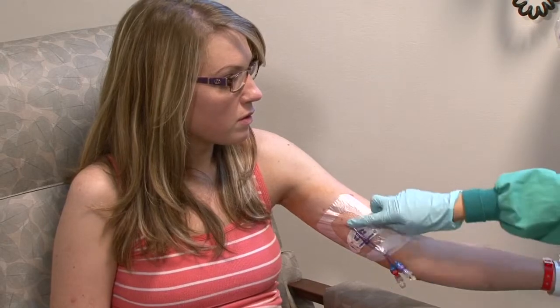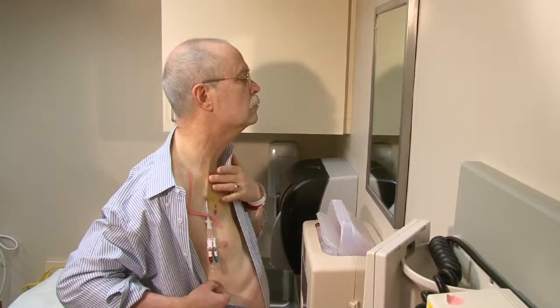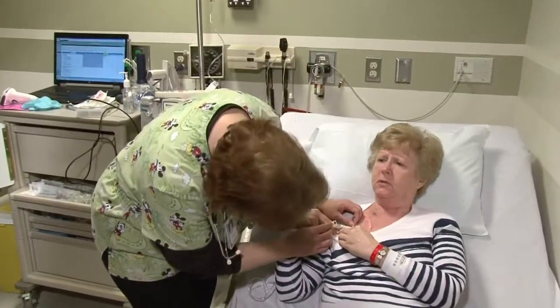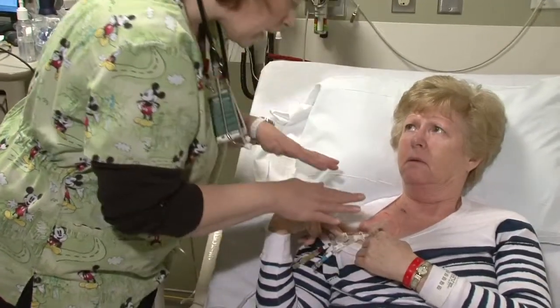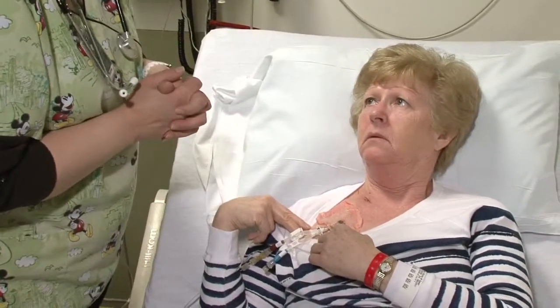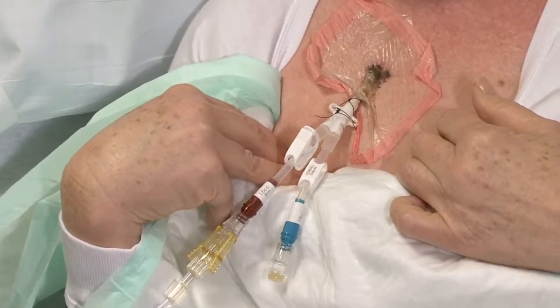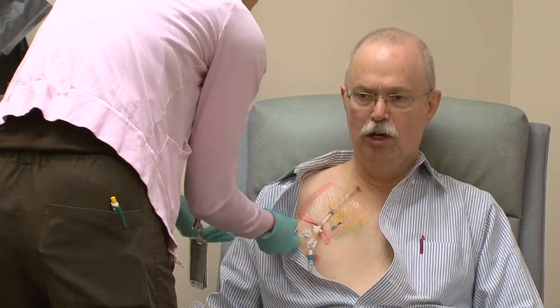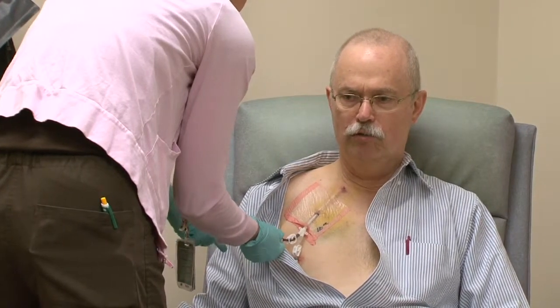Your central line might exit your body in your arm, upper chest, or your neck. There are different types of central line catheters. The type of catheter that you have, the location where it was placed in your body, and where it exits your body were determined by your healthcare provider based on your healthcare needs. You might have a catheter that is surgically inserted under your skin and then tunneled into the large vein leading to your heart. A small cuff helps hold the catheter in place. These are often called tunneled lines.